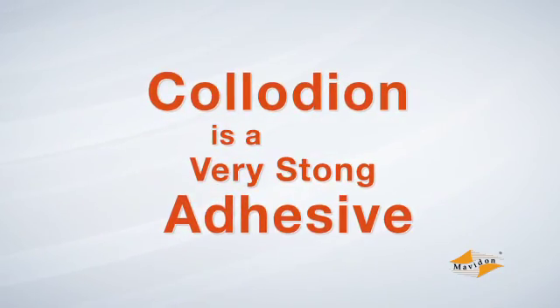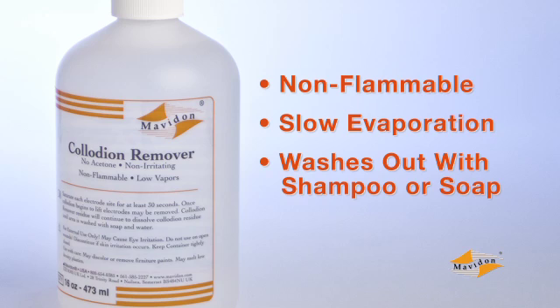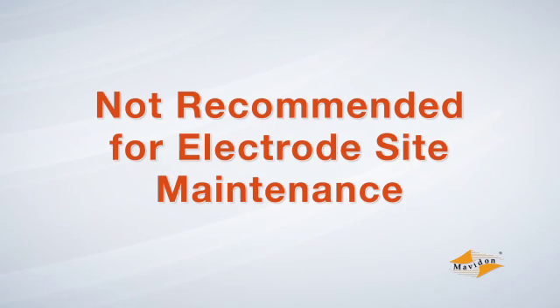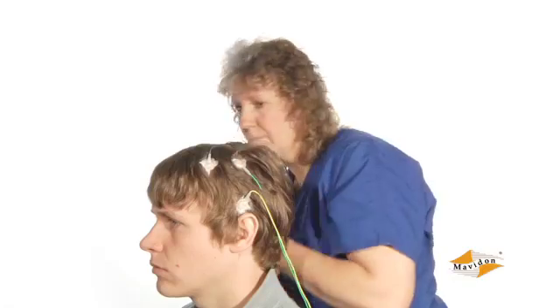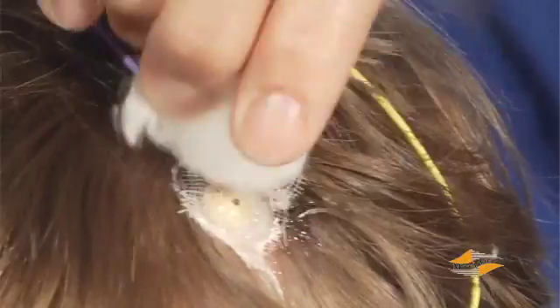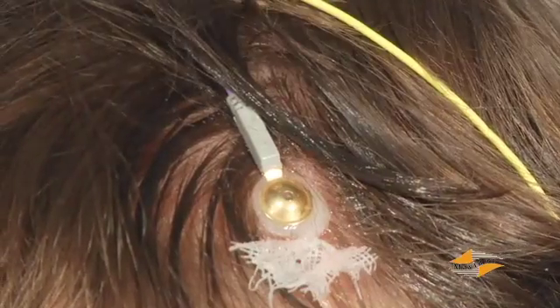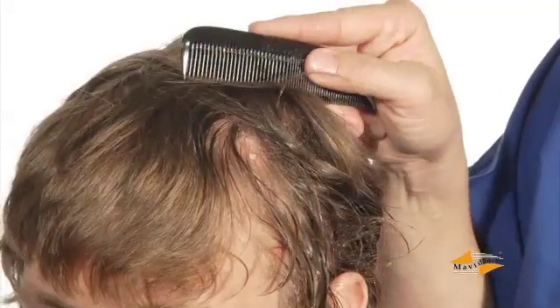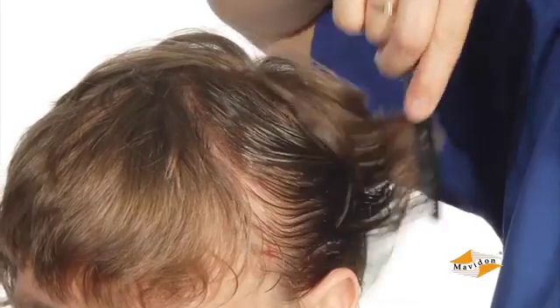Collodion is a very strong adhesive. Mavidon's collodion remover is a proprietary blend of mild solvents specially designed to soften collodion to facilitate removal. It is non-flammable and its slow evaporation rate means far fewer fumes, and it washes out completely with any mild shampoo or soap. Note that collodion remover is not recommended for electrode site maintenance, as it will inhibit collodion from reattaching. Apply the remover liberally to each electrode site to soak the collodion, then repeat for all sites. By the time you soak the last one, the first electrode will be loosening up. The oily feeling is a moisturizing oil that helps dissolve collodion and protects the skin and hair from drying out. After removing all the electrodes, comb out as much of the residue as possible, but let the collodion remover remain, allowing it to continue working until the patient washes their hair.